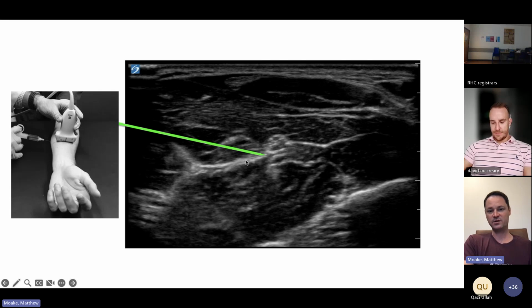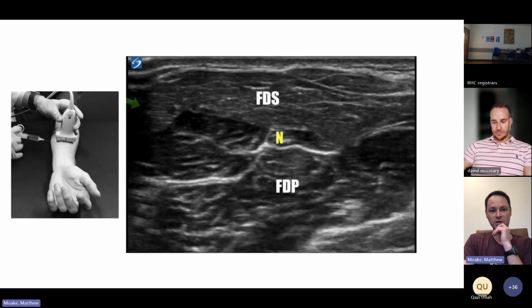And so even if you actually hit this further away right in that fascial plane, you'd be able to see your fluid dissect in and around the nerve. You hit that plane just right, which is the same concept we're doing for a lot of the more proximal field blocks. So here you've got the anatomy and the nerve.